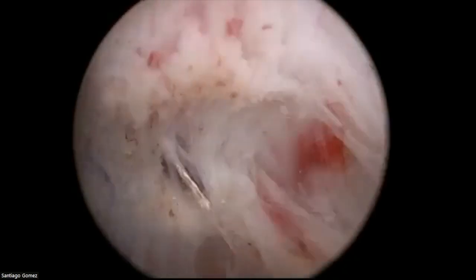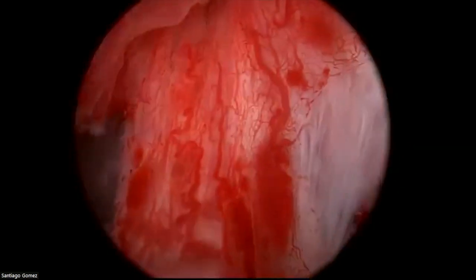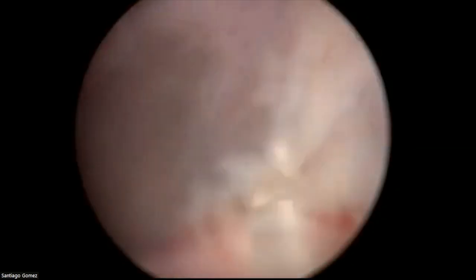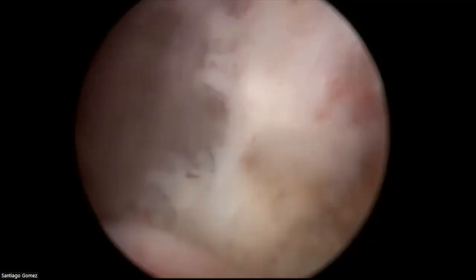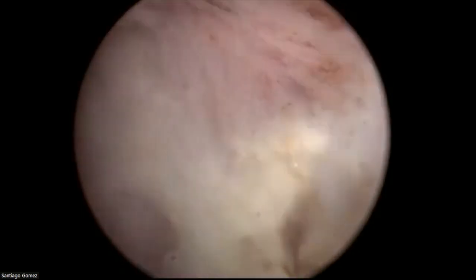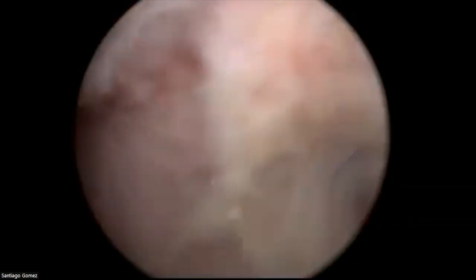Then of course, when you have progressed a little bit, you can see that you have two spaces, one space, the other space, and now we cut in the midline. It's similar to what we will do at 12 o'clock, but in an opposite manner when we want to release the sphincter anteriorly. So we come from both sides and we leave it for the end.